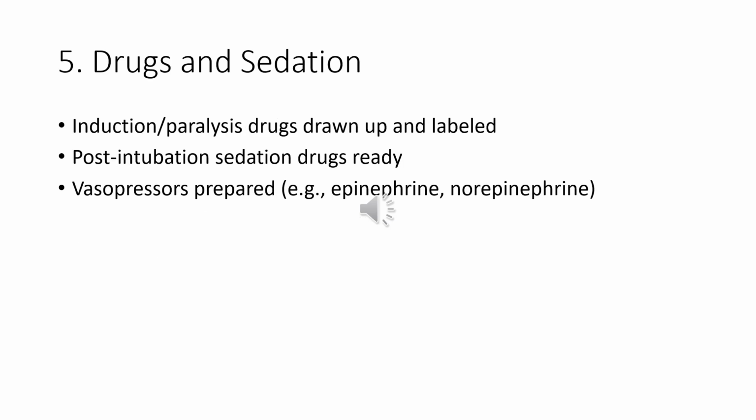Prior to the intubation, induction and paralysis drugs should be drawn up and labeled. Post-intubation sedation drugs should also be ready to ensure the patient maintains comfort and safety post-intubation. Ready access to vasopressors allows for rapid treatment of peri-intubation hypotension.